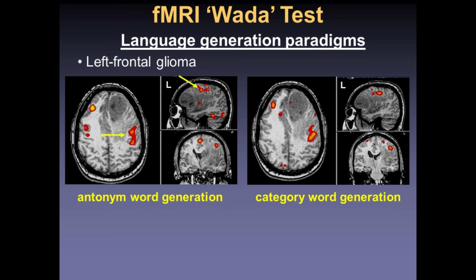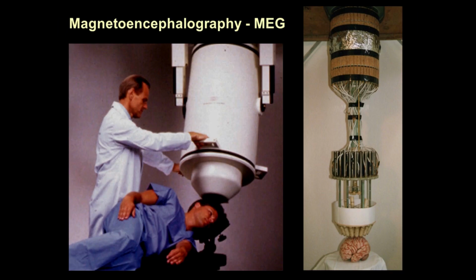What about functional MRI, which is, of course, based on deoxyhemoglobin, oxyhemoglobin shifts? Well, we certainly use this for mapping in epilepsy patients with or without lesions and look at memory sometimes, but because functional MRI is inherently limited by hemodynamic responses, whereas epilepsy is measured in milliseconds, it's inherently ill-posed to answer the question of where the epilepsy came from. Besides, we can't have patients sitting in our scanners for hours waiting for a seizure to occur. So practically speaking, a very good tool, but not specifically for the epileptic zone localization.